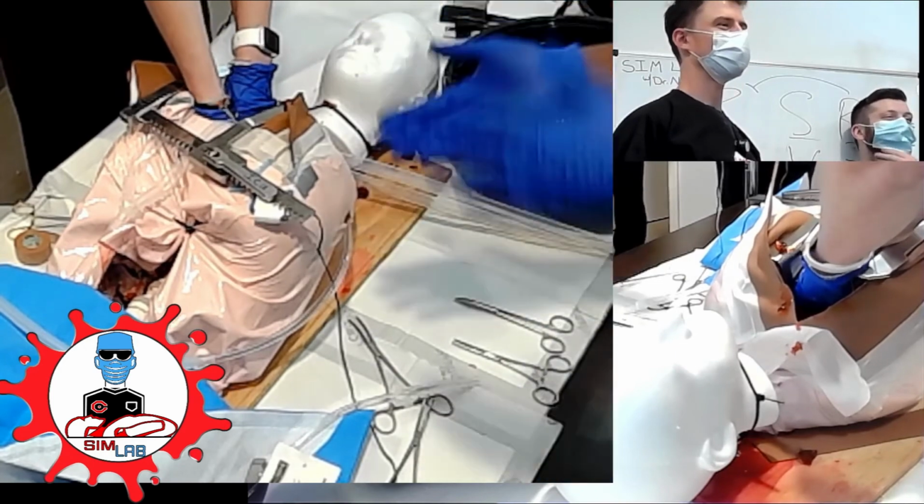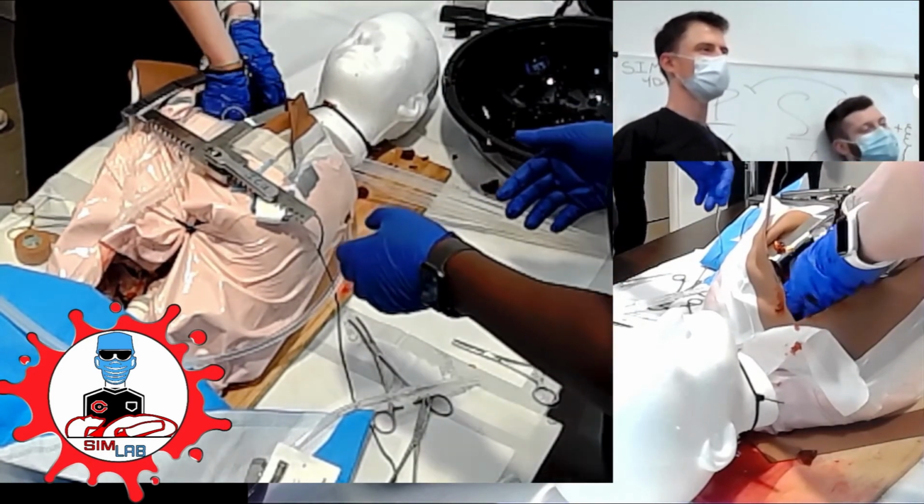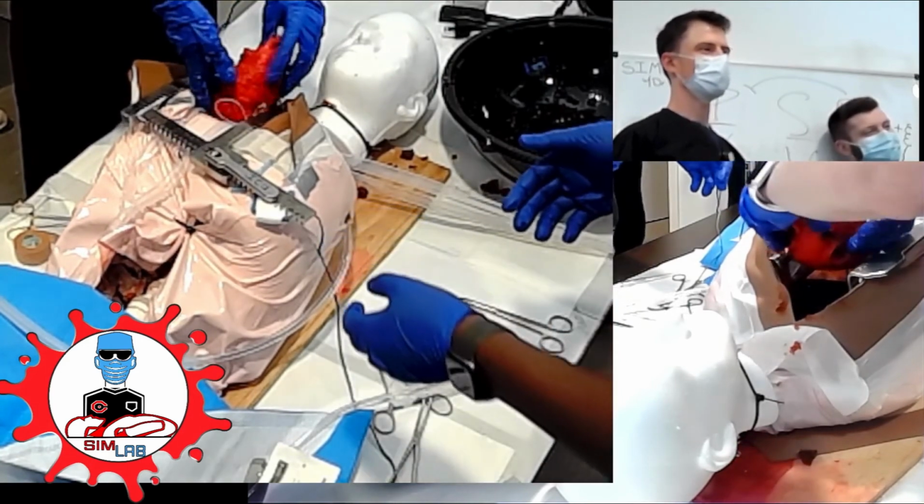She's already been in there. You can take the heart out if you want. It's detachable, and just demonstrate for the group how you would massage the heart.